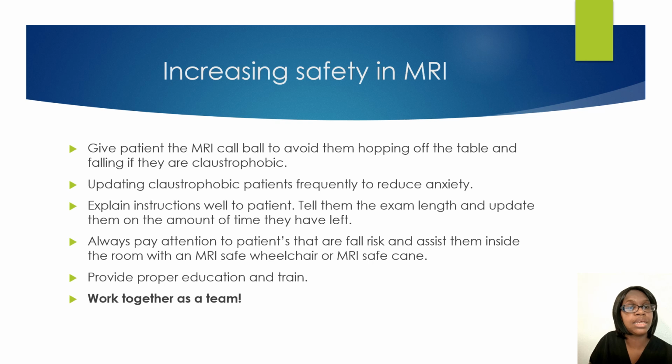To increase safety in MRI, give the patient the MRI call ball to avoid them hopping off the table if they are feeling claustrophobic. Update the claustrophobic patient frequently to let them know how much time they have. This reduces the anxiety. Provide proper instruction, education, and training on patients and other coworkers that you work with, because we want to work as a team. We want the patient to understand if they hold still, the exam will be completed in a timely manner. So you just want to make sure that you are also providing an MRI safety wheelchair for patients who are at fall risk. So all of these things you do, it will increase safety in MRI.